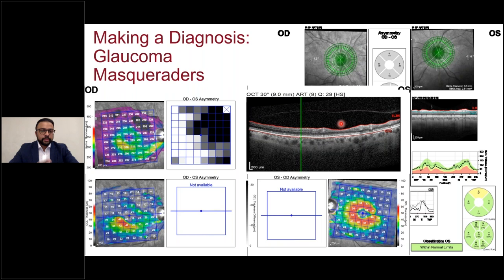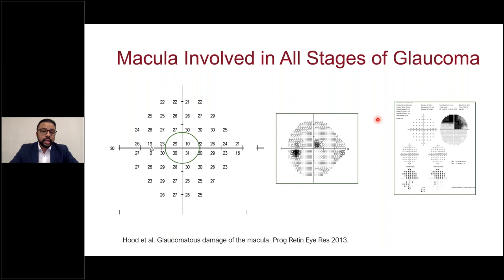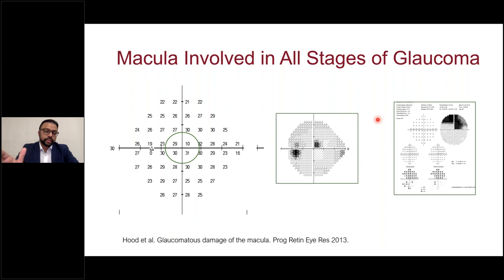One might say this patient has a BRAO and doesn't have glaucoma, so take them off drops. But we talked about green disease. Looking more closely at the left eye, there's actually a focal dip superior-temporally on the T-SNIT, and there is corresponding asymmetry with loss in an arcuate pattern in the superior macula. The patient likely has concurrent glaucoma. Glaucoma is defined by change over time, so we have a baseline and will monitor over time. This is another scenario where a non-glaucoma entity confounds our measurements, and also an example of green disease.